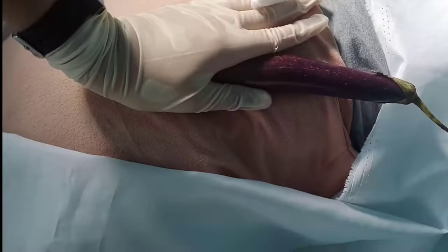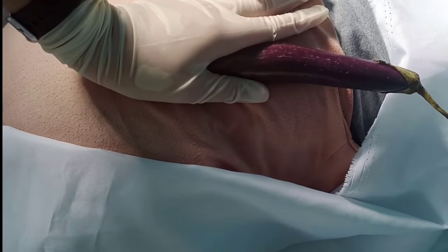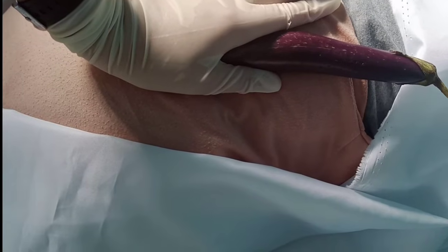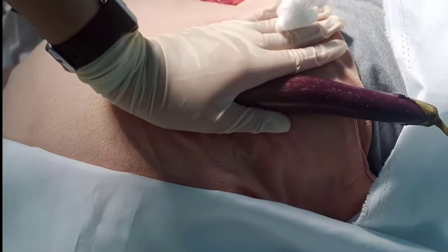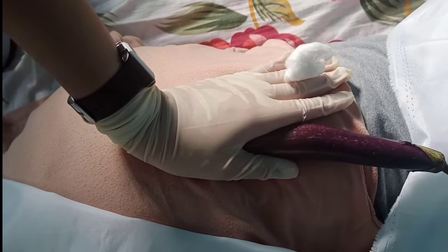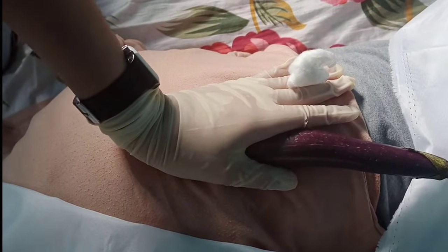Hold the gauze pad between the third and fourth finger of the non-dominant hand and then uncap the syringe and hold the syringe between the thumb and forefinger of the dominant hand as if holding a dart. Place your ulnar side of your non-dominant hand just below the injection site and pull the patient's skin laterally about 1 to 1.5 inches. Hold the position until you insert the needle.